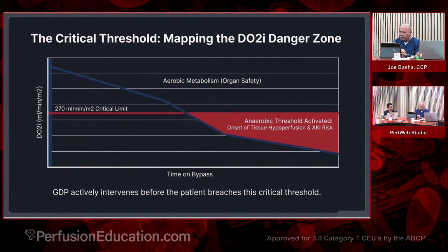So the brain, surprisingly enough, as long as you have flow, can operate in a much lower oxygen tension state for a longer period of time than the kidneys actually can. Right. And we see that with our ECMO patients when we're trying to do ventilatory rest settings. We will accept a saturation of 78%, which is damn near venous saturation, right?